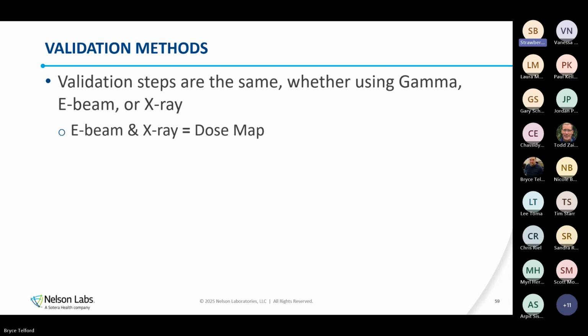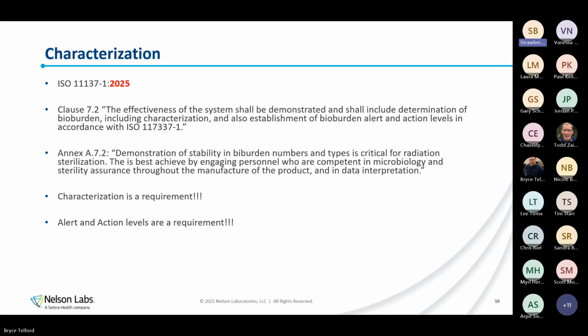I had a question in terms of if you have products in terms of families, will that be affected with this characterization, or are you able to still leverage? So yeah, the answer is yes, you can still do family groups.